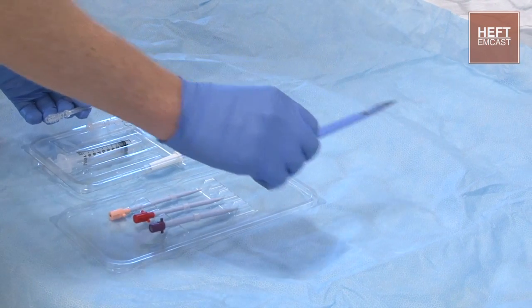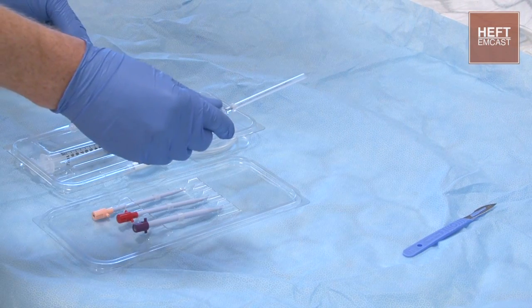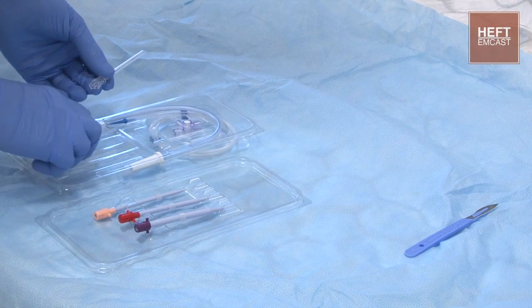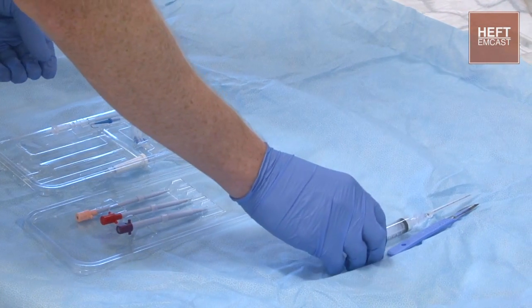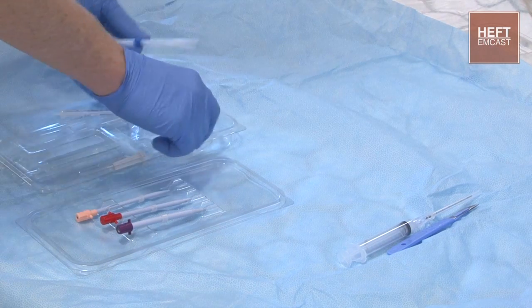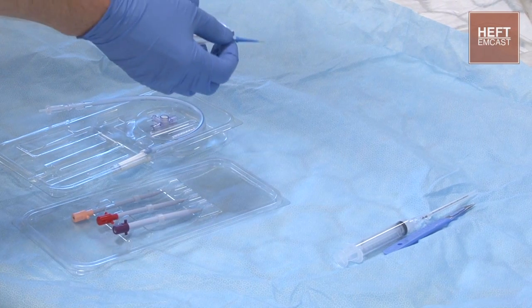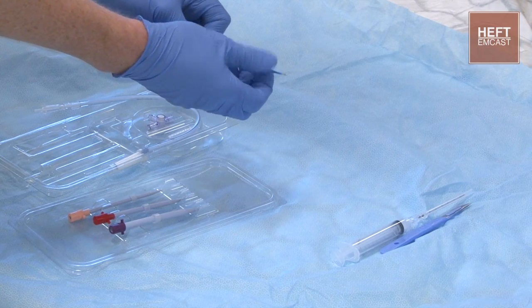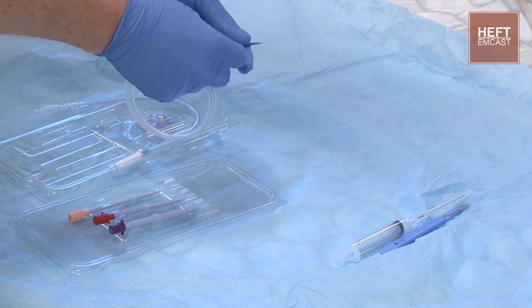So piece by piece, we've got the scalpel for the skin incision. We've got the introducer needle that the wire is going to be fed along, and we've got the syringe that that attaches to. We've got the guide wire that we're going to be placing down the introducer needle. The bevel on the end will unscrew, and then the wire can be fed down.